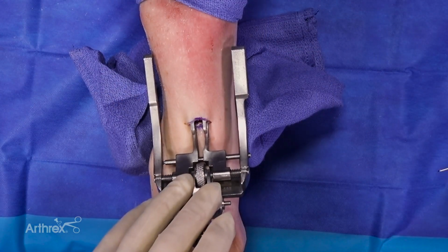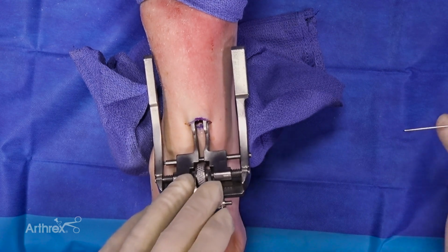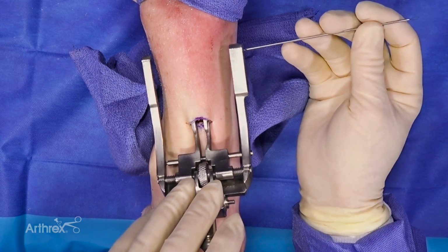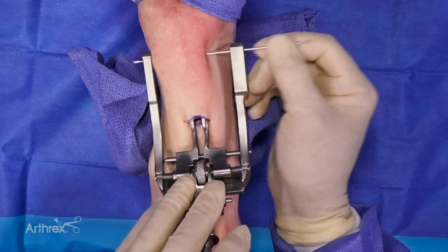So with our device in, and now we've captured the tendon itself, we're going to place our needles. The set that you have will come with 3 needles. You're certainly welcome to use all 3 at one time. My preference is to use 2 needles. I think regardless, it's important to stabilize the unit, the PARS unit, to the tendon itself.